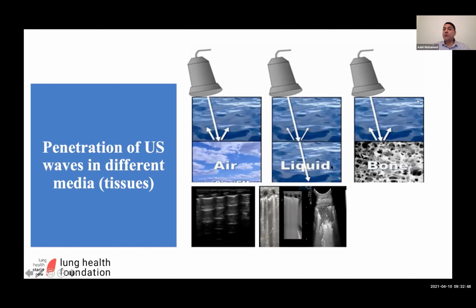And if it progresses more, to the point that there is no more air, the air is zero, and everything is replaced with fluid, as in the case of pneumonia, this is how it will look.